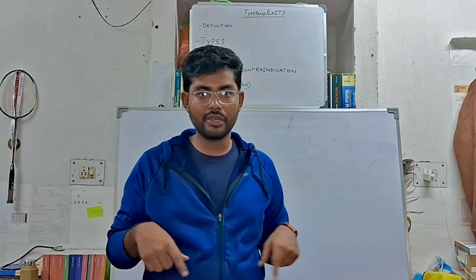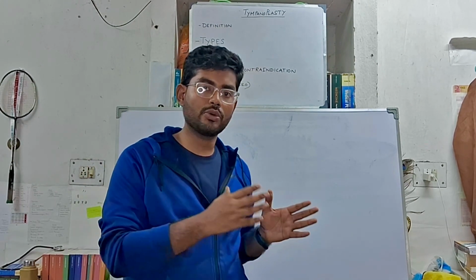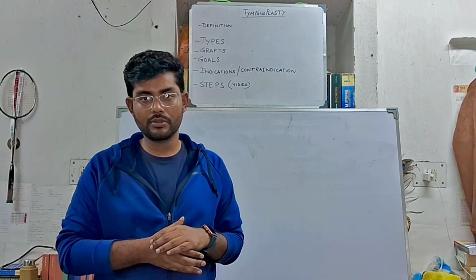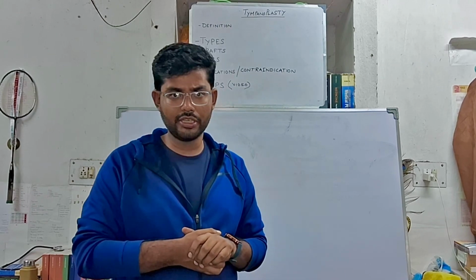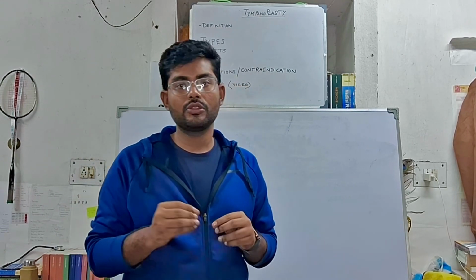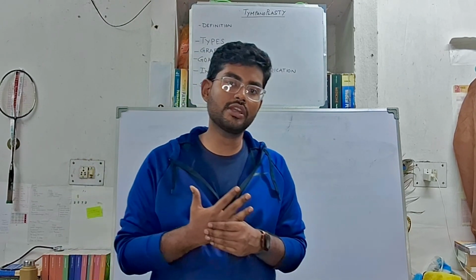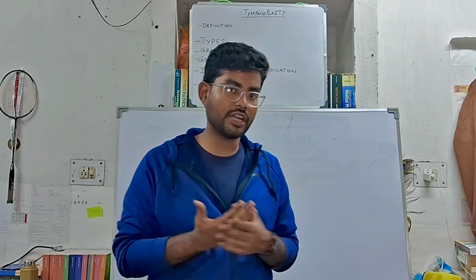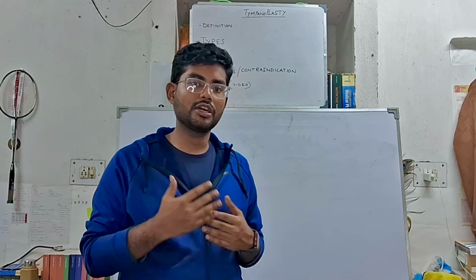even if the tympanic membrane remnant is present, we have to remove that, because those tympanoplasties are always combined with a mastoidectomy procedure, most commonly the canal wall down technique. You have to perform a canal wall down technique to perform a type 3, type 4, type 5, type 6 tympanoplasty. So in those cases, the tympanic membrane remnant is no longer present. So basically what we are placing as the graft acts as your new tympanic membrane. It is not a new tympanic membrane per se, it is only the graft that is present. So in those cases there is no repair of the tympanic membrane. We are placing a new graft.